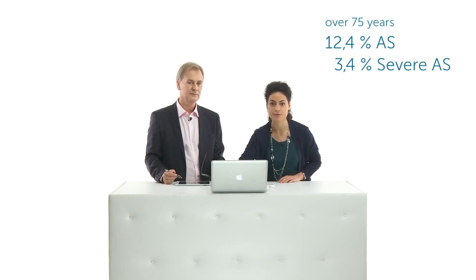Yes, and as a matter of fact, the prevalence of aortic stenosis in patients over 75 years has been estimated to be 12.4% and 3.4% in case of severe aortic stenosis. But I guess the most important thing is, aortic stenosis can really well present as emergency. And I perfectly remember a lady who came once to the emergency department because of syncope, and the diagnosis was made really fast thanks to echo. It was a case of severe aortic stenosis combined to poor left ventricular function.